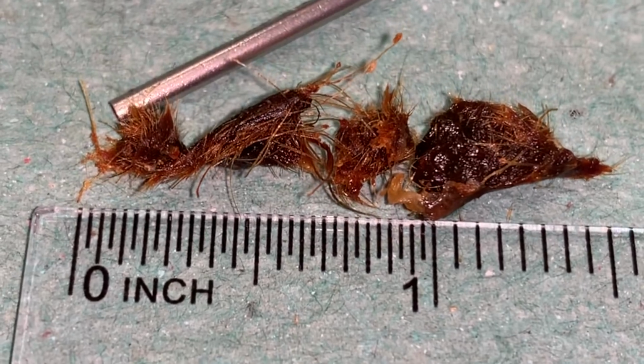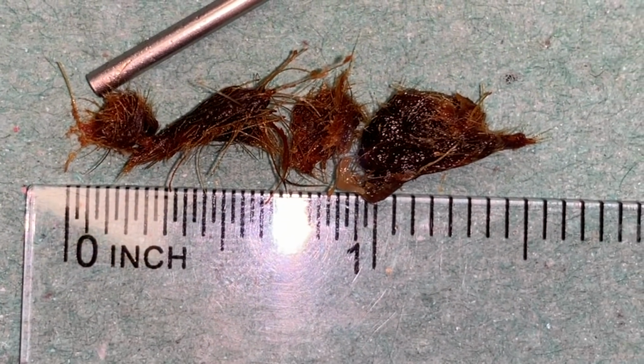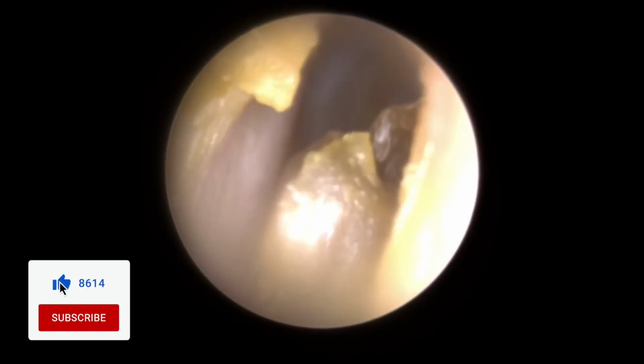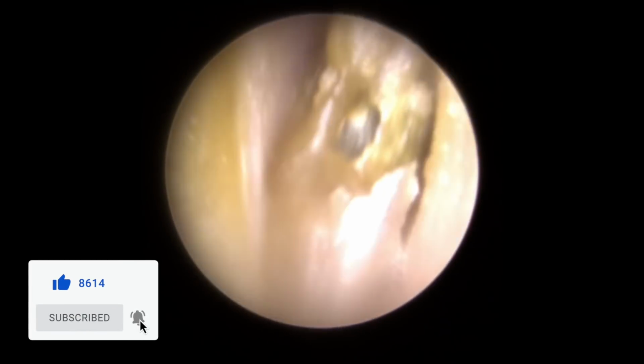So we do have lots of people asking us why we don't use the St. Bart's hook very often. I find that the opportunity for using the St. Bart's hook is quite limited, because you have to have a very special set of circumstances to be able to get that wax out using the St. Bart's hook, which is exactly what we have here.